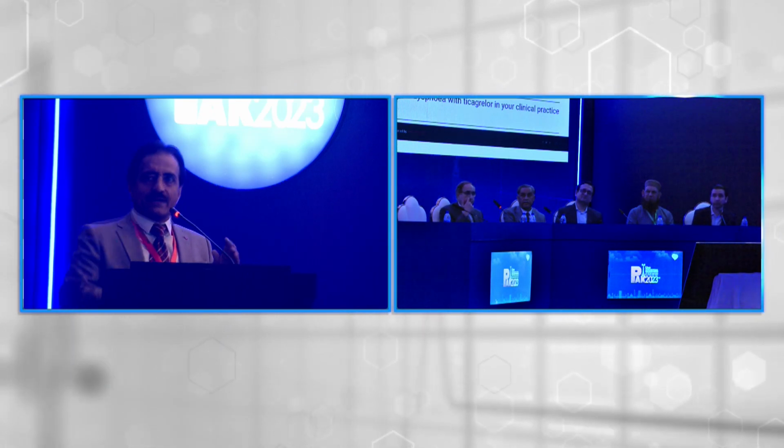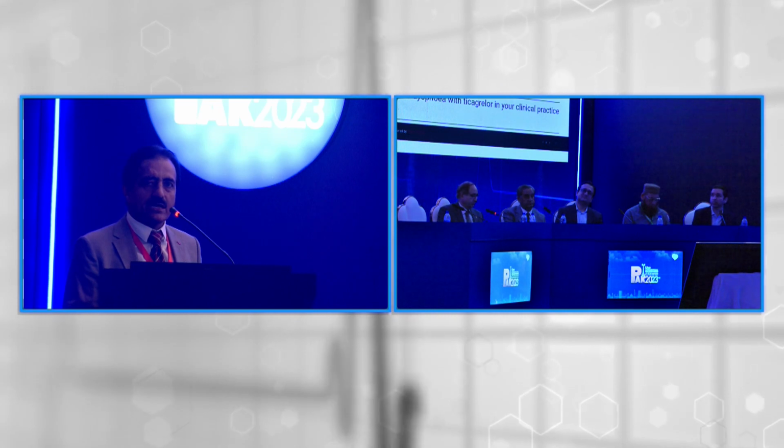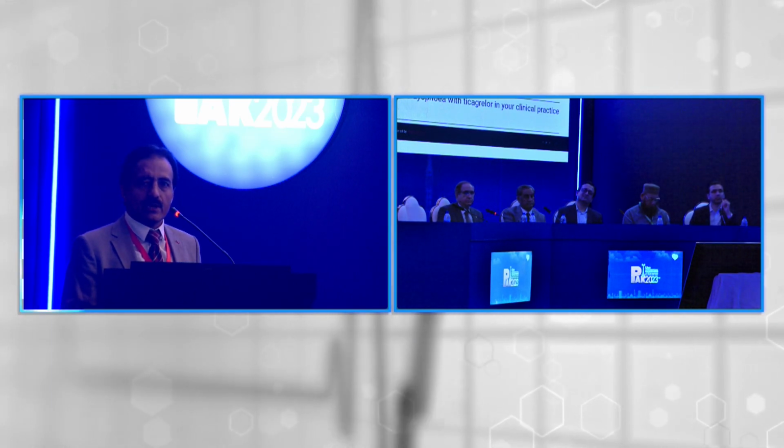So I think it's perfect timing after this talk on bifurcation and ostial circ and ostial LAD. We thought we'd present actual cases of ostial circ and ostial LAD and get comments on how they should be treated, either ostial stenting coming to the left main or not. So I think these are two very interesting cases, and we will discuss them.